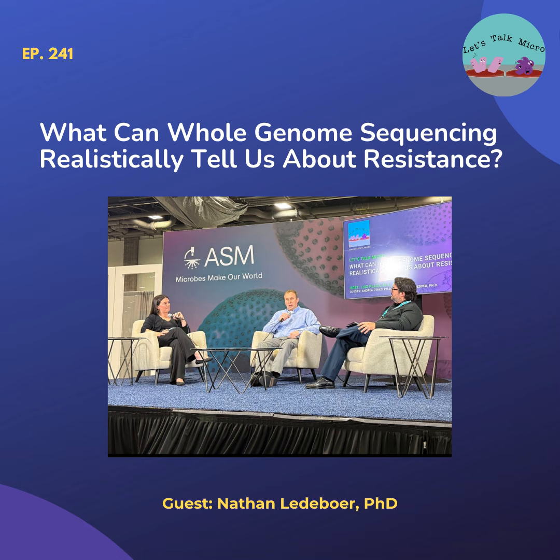If we're going to be doing whole genome sequencing, then the question becomes, are we dealing with an isolate that we're sequencing, or are we dealing with a patient sample? Because there are different challenges that we have to overcome in that space. If we're dealing with an isolate, finding individual SNPs and associating them with individual genes is relatively easy, and doesn't take a whole lot of sequencing depth.